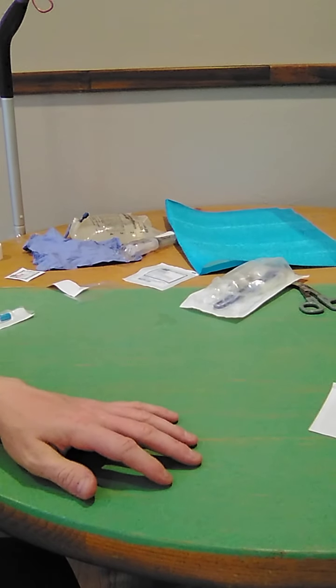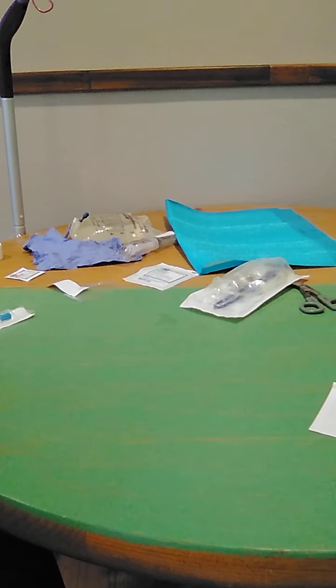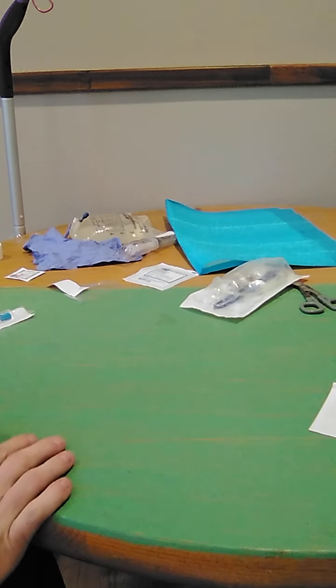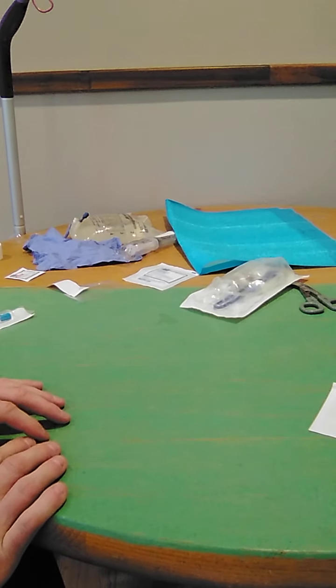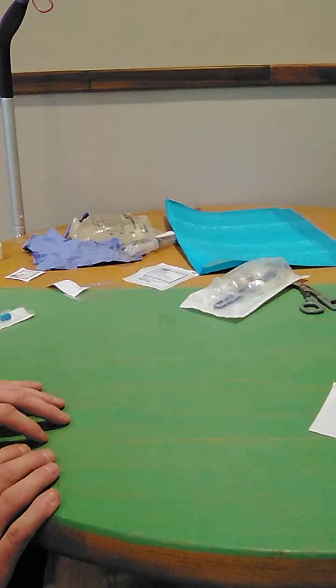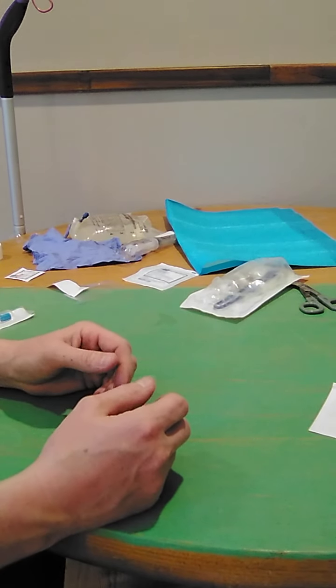So, firstly, I'm going to approach the patient, perform my hand hygiene, make sure the environment appears safe, that the bed is at a comfortable working height for me, that the guardrails are up to ensure the patient's safety, and that we're affording privacy as well as body mechanics of myself and the patient.